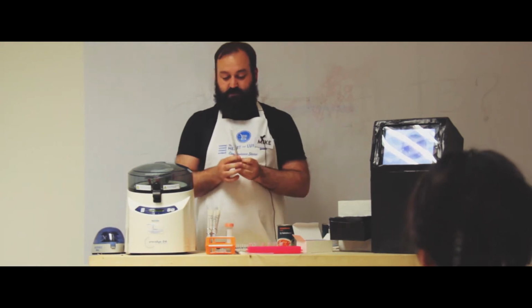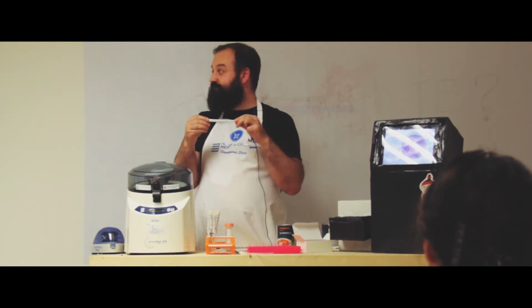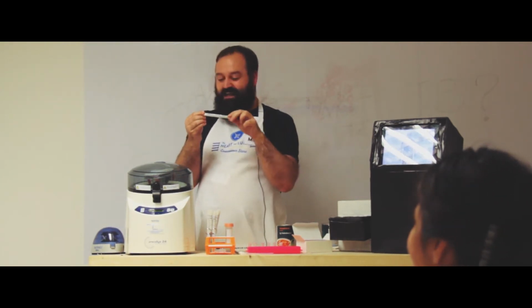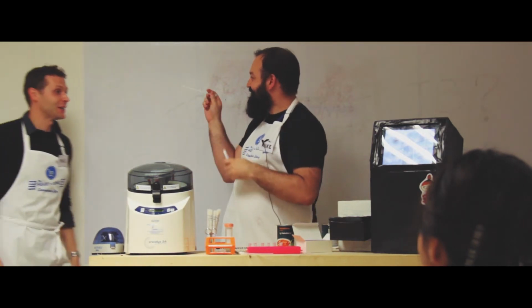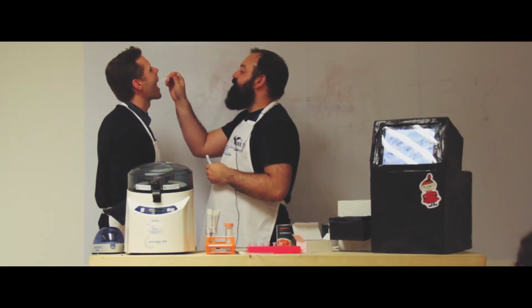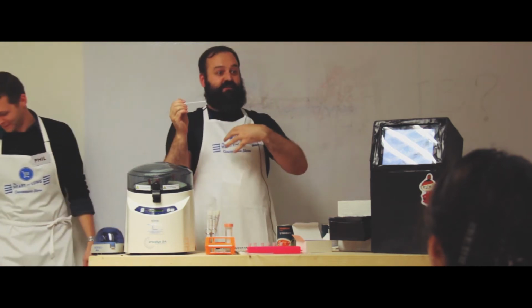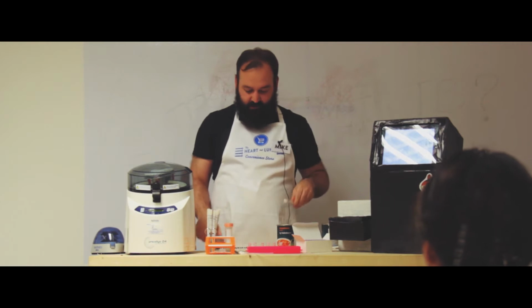So here we go. You're going to take a sample, and this is a throat swab. Phil? We've got to show it for real, right? How's your gag reflex? We'll find out. Here we go. Right, so right at the back of the throat, because the bacteria at the back of your throat are very similar to the bacteria down within your lungs. So that's Phil's sample, all sorted.